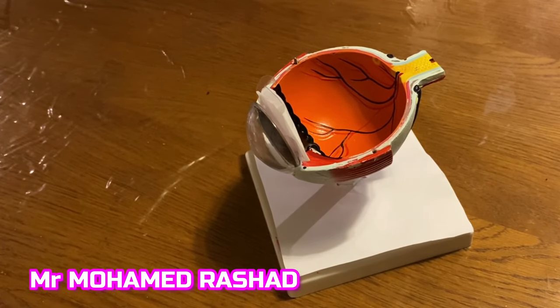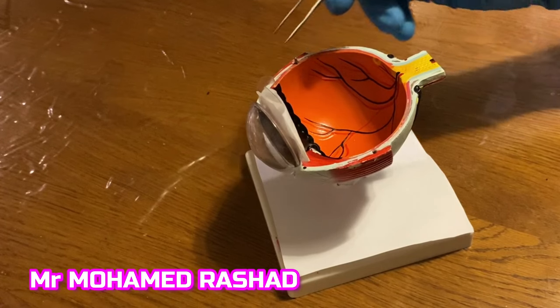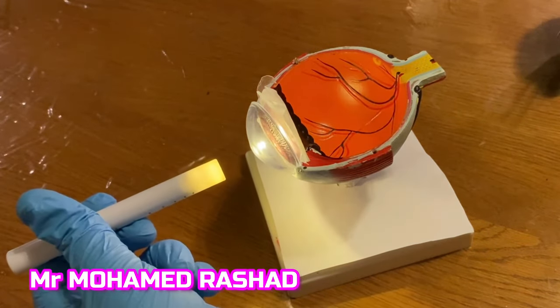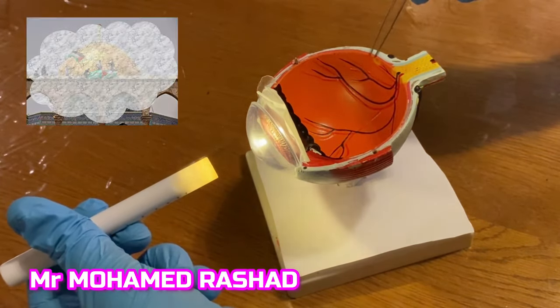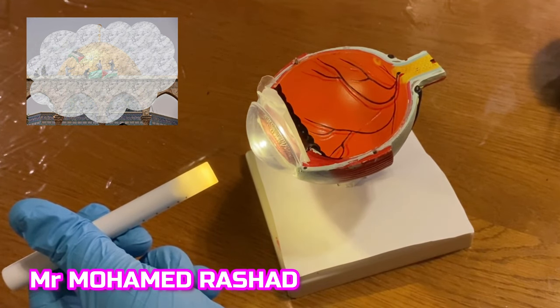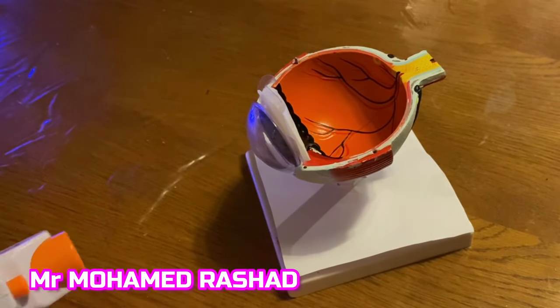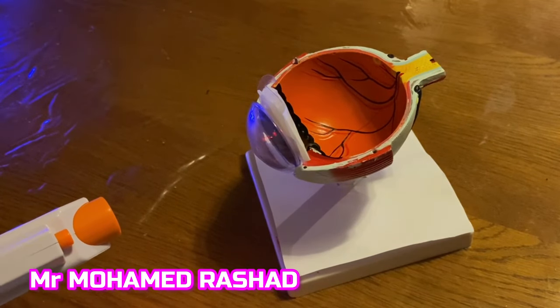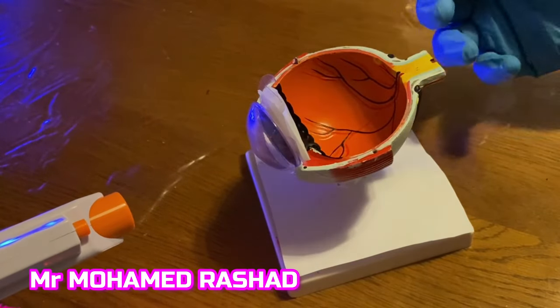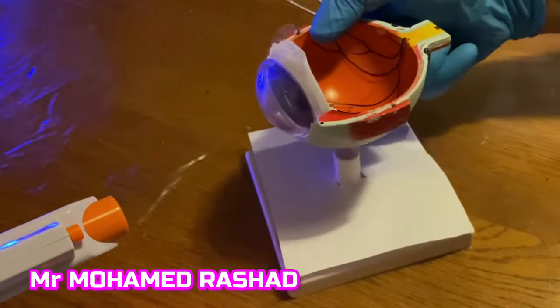In 10% of people having cataract surgery, the bag holding the clear lens becomes cloudy. When the light shines in front of the eye, it cannot be focused on the retina and the patient cannot see a clear image again. The idea of the YAG laser is to make an opening in this cloudy membrane that forms behind the clear lens.